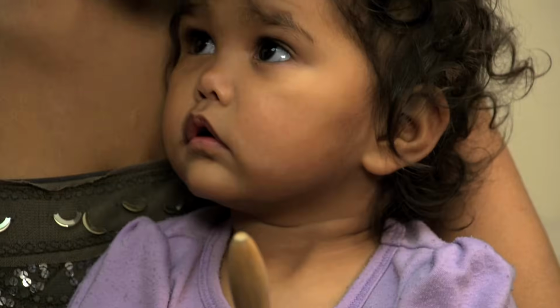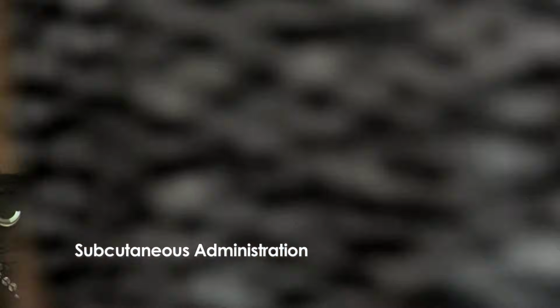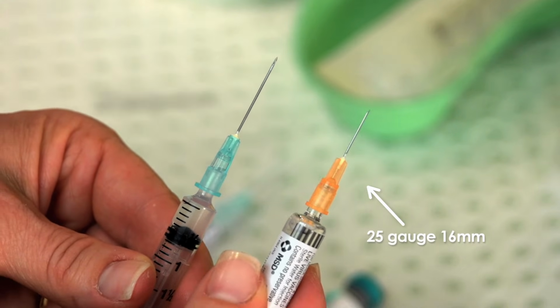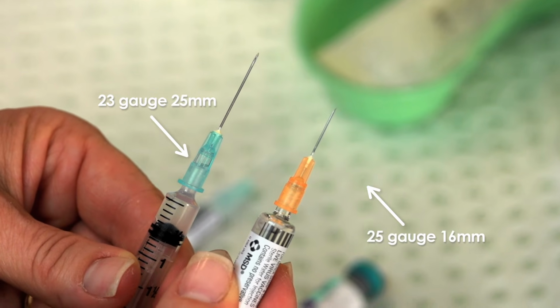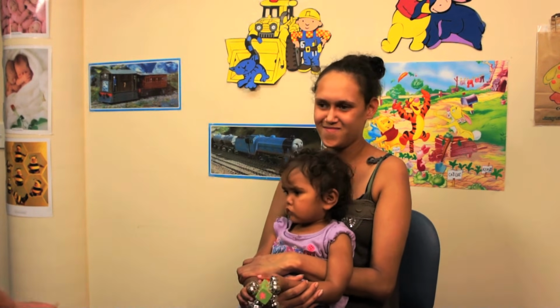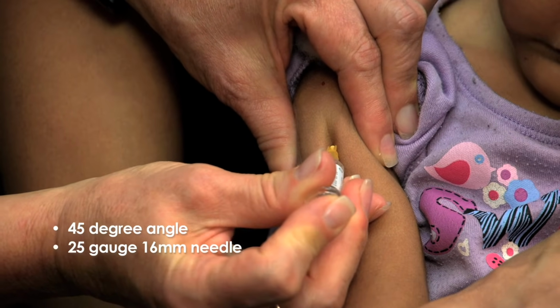This 18-month-old Aboriginal child also needs 2 injections, which includes a subcutaneous vaccination. As can be seen here, the subcutaneous needle is shorter in length compared to the intramuscular needle, as it only needs to go into the subcutaneous layer. This subcutaneous injection will be administered over the deltoid muscle area. The subcutaneous injection is administered at a 45-degree angle to the skin, using a 25-gauge 16mm needle.